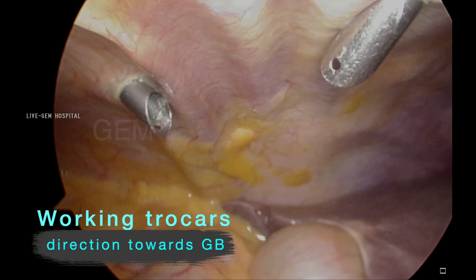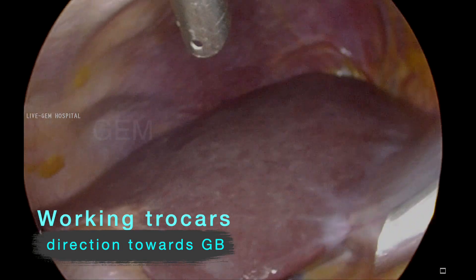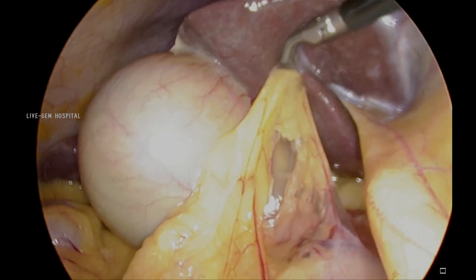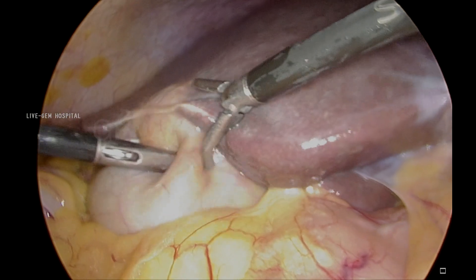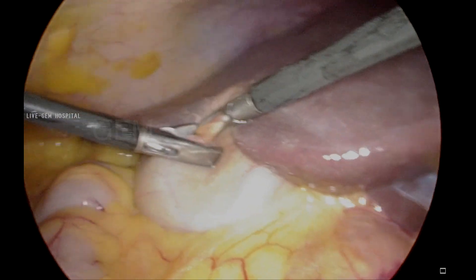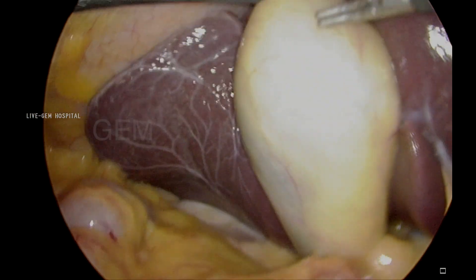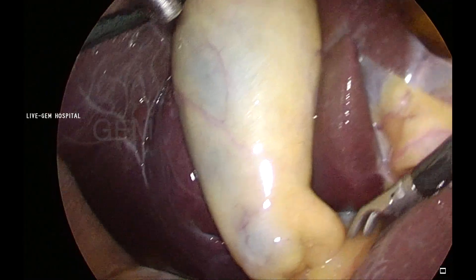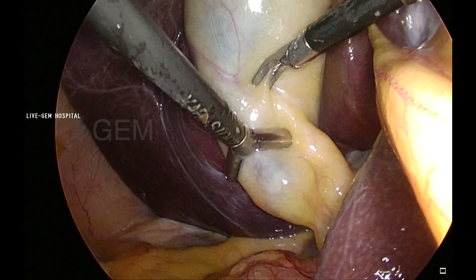All the ports are spaced towards the gallbladder so that port-site pain will not be there in the postoperative period. Why am I making a 5mm in the epigastrium? I am going to convert it into 10mm for clipping — when a 5mm instrument comes through a 10mm port, the stability will be less. That is why I want a very stable instrument for the critical dissection, so I put 5mm initially.